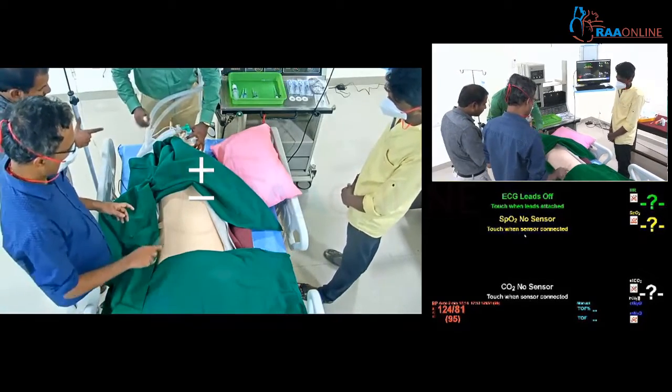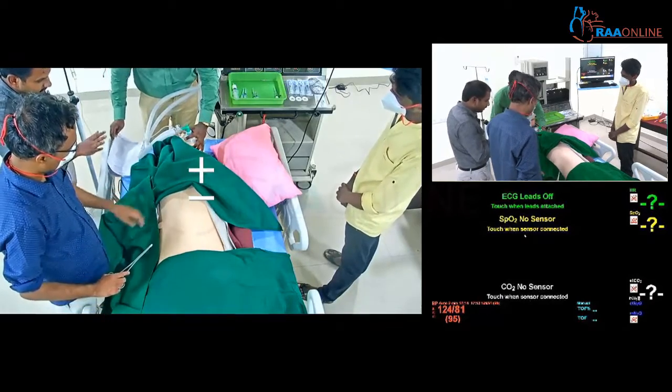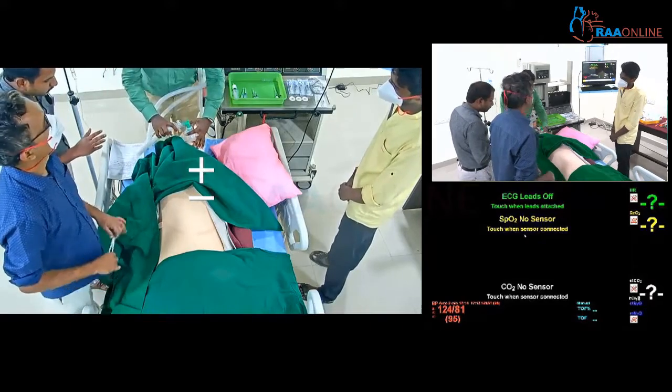Consent for anesthesia? Yes, sir. Anesthesia consent has been obtained, sir. Okay, IV line was taken? Yes, sir. Okay, so we will give pre-oxygenation.